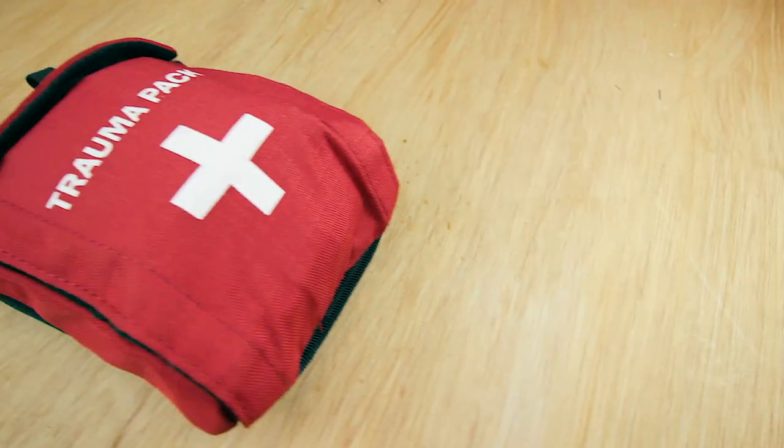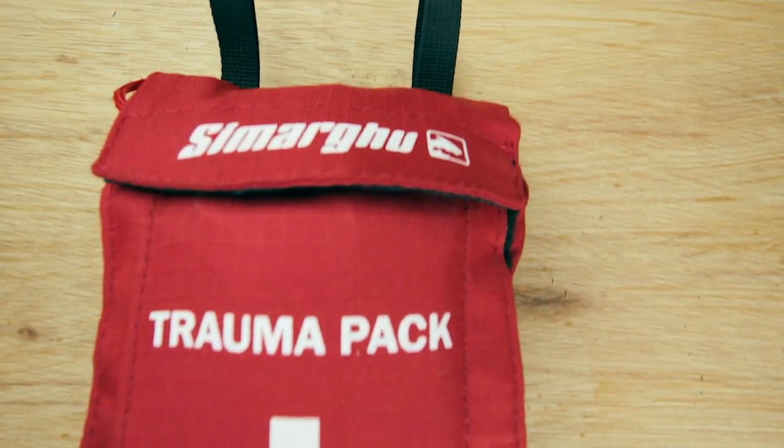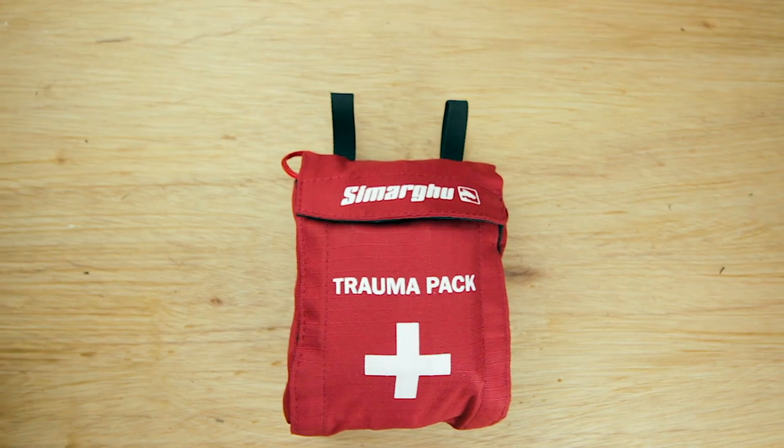What I'm going to talk about today is this Simarghu personal trauma kit. It's something I'm really passionate about in terms of having something on yourself in the field when you're climbing and doing that sort of work — a trauma pack for self-care.